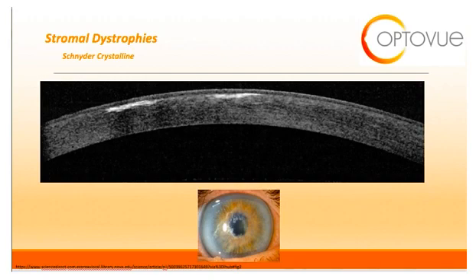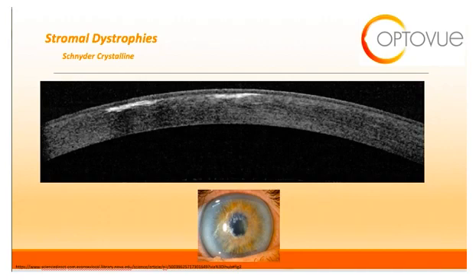The last stromal dystrophy I will discuss is central crystalline dystrophy of Schneider. This appears clinically as fine yellow-white anterior stromal crystals located in the central cornea. On OCT, you will see dense hyper-reflective tissue more visible in the anterior stroma, with the epithelium and Bowman's membrane being spared.